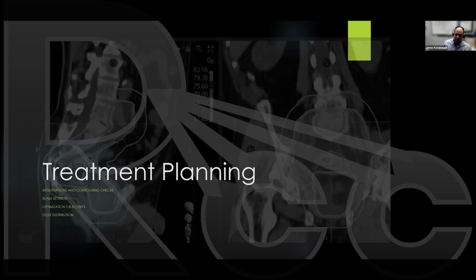Oh boy, we've had so many conversations on this topic. So really full bladder, if you only think about dosimetry, sounds great because you're moving all this anatomy far away. So uncomfortable, and we've had so many patients that just can't do that during treatment, and they come back and they have to go to the bathroom halfway through treatment. Now you got an empty bladder, or what is really full varies day to day. So moving away from that, reasonably full is what our goal is.